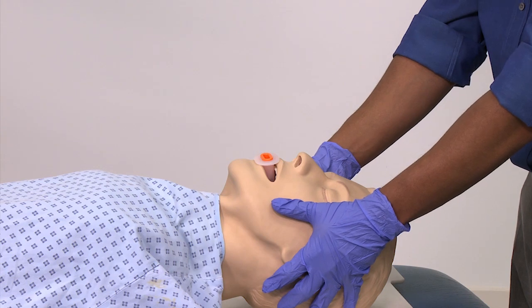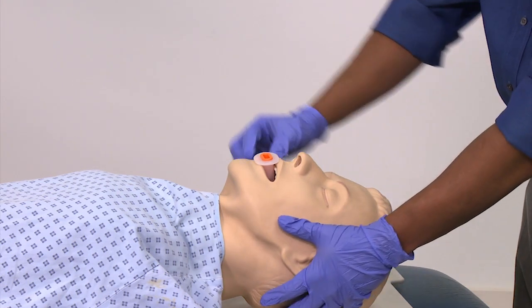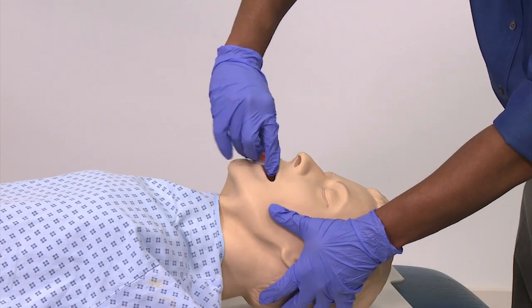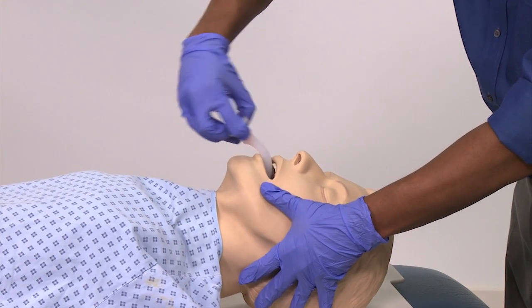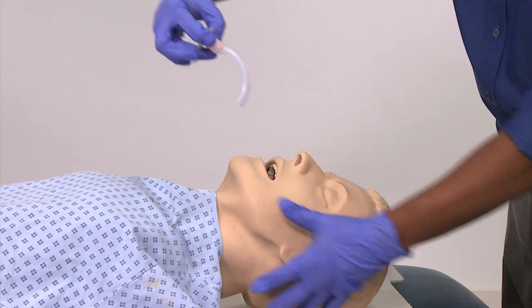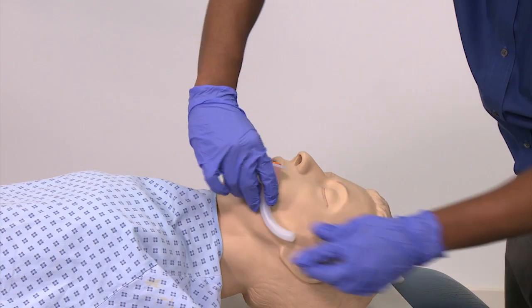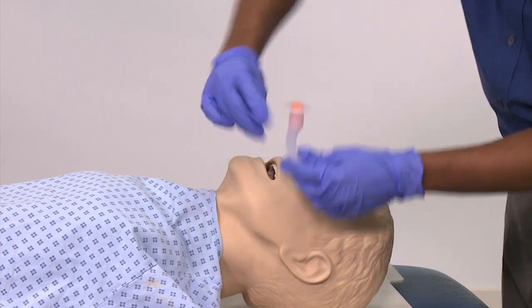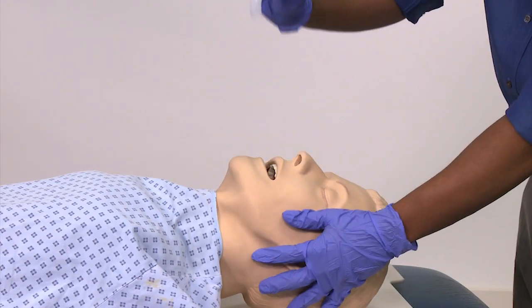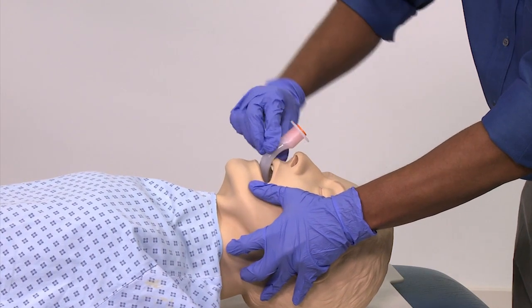If the patient starts to gag upon insertion, remove the Guedel and check the size is correct, then re-attempt insertion. If it is still not possible, consider abandoning the procedure and returning to manual airway manoeuvres.